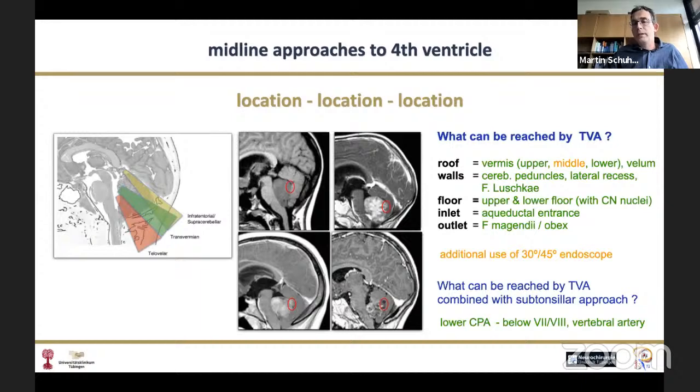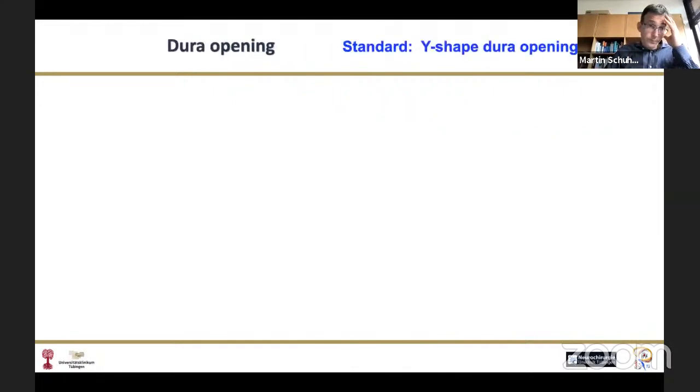So you can see 7 and 8 from down there. You can see everything, the cranial nerves down to the entry of the vertebral artery. So by this little extension opening fully the lateral recess, you also gain a very good access. And I'll show you examples that we need this in pediatric neurosurgery into the cerebellopontine angles.